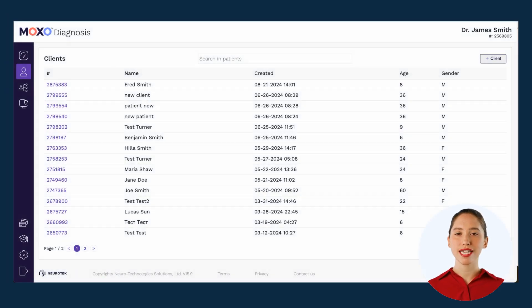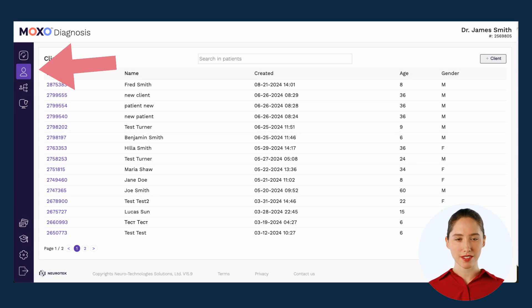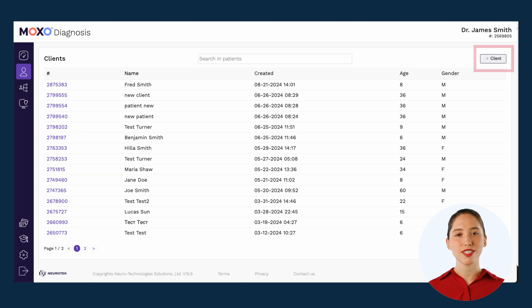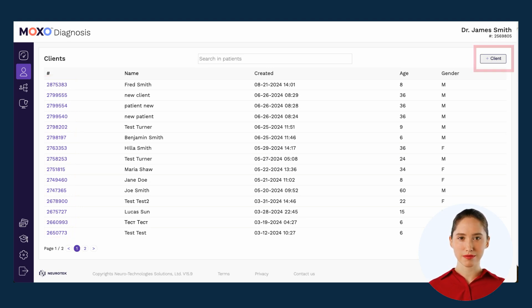The second way to add a new test is from your client's page. If this is an existing client, click the client number on the left. If this is a new client, click plus client in order to create one.